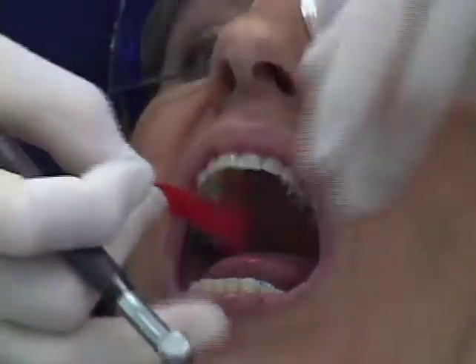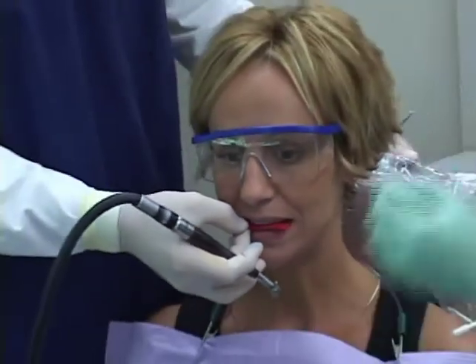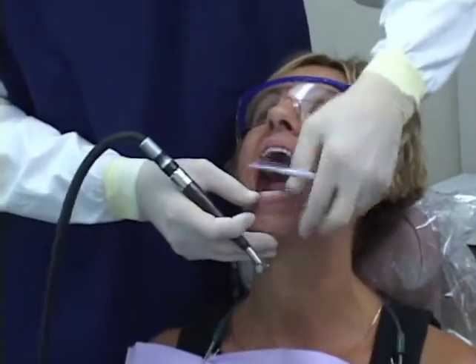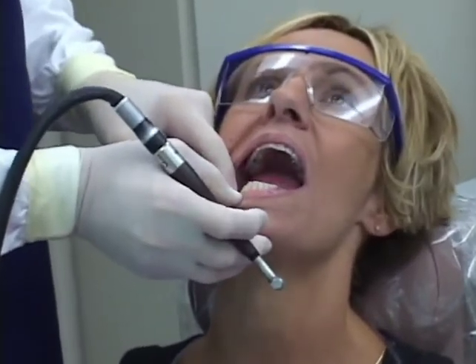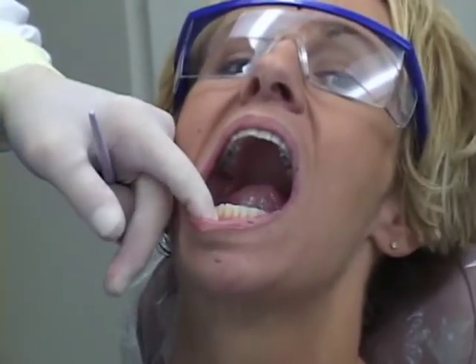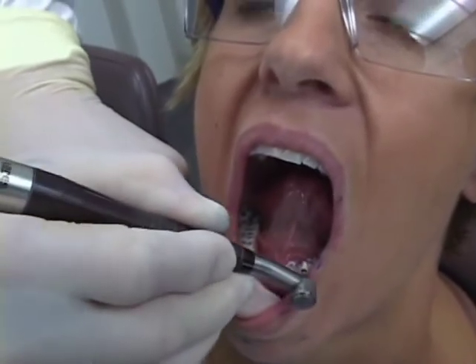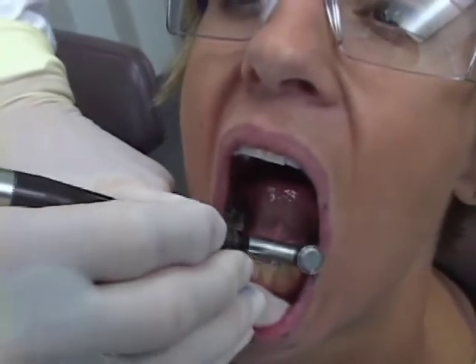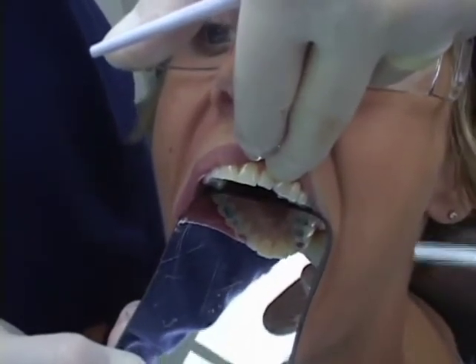Go ahead and chew again with the red silk - just chew on your back teeth. Now as we look at this, what we'll see clearly is there are no red marks on the anterior teeth. Very nicely, we can see red marks on numbers 22 and 27 - that mark is really probably just a centric stop. On the uppers, there are no red marks at all on teeth 7 through 10. We have nice heavy guiding contacts on numbers 6 and 11, which is exactly what we want.